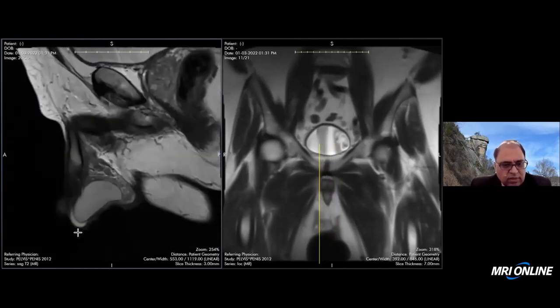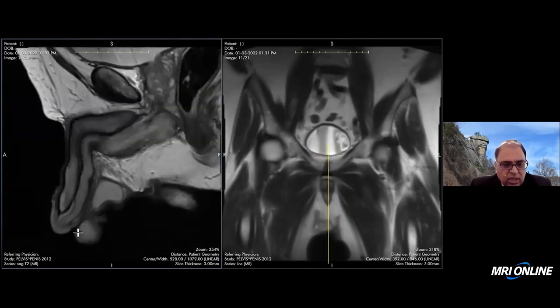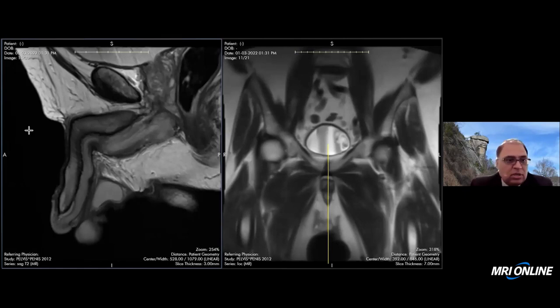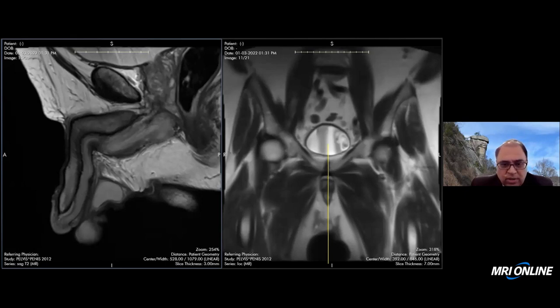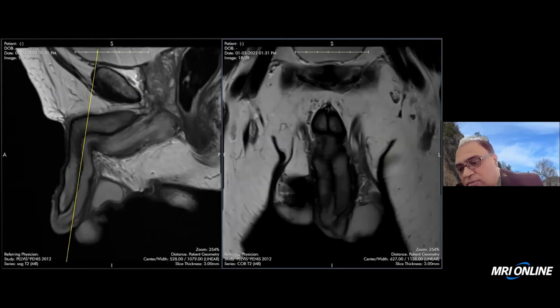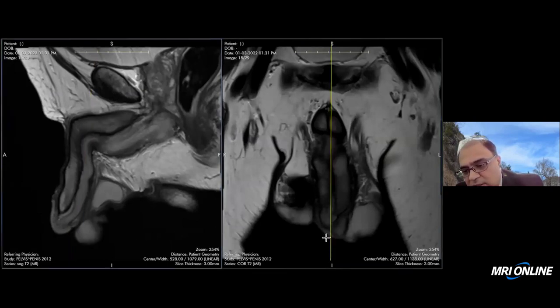Otherwise, I do not see any mass. We already know this is a case of carcinoma in situ, which should be a very small tumor. The surgeon just wants to rule out the possibility of local extension underneath. After this, I will move to the coronal images and see the same area on the coronal if I can find more.